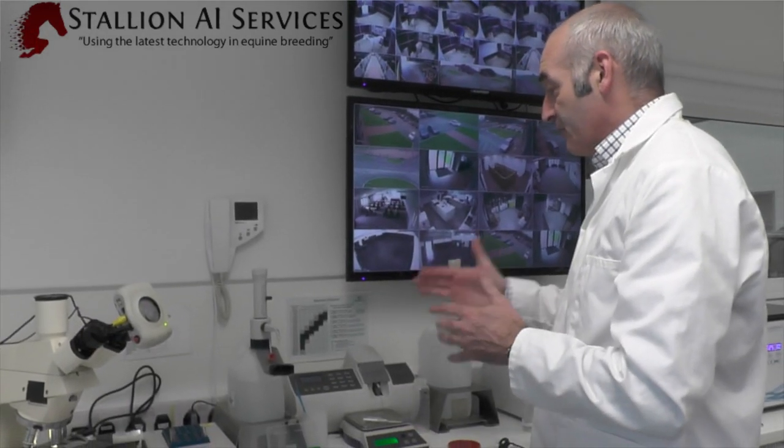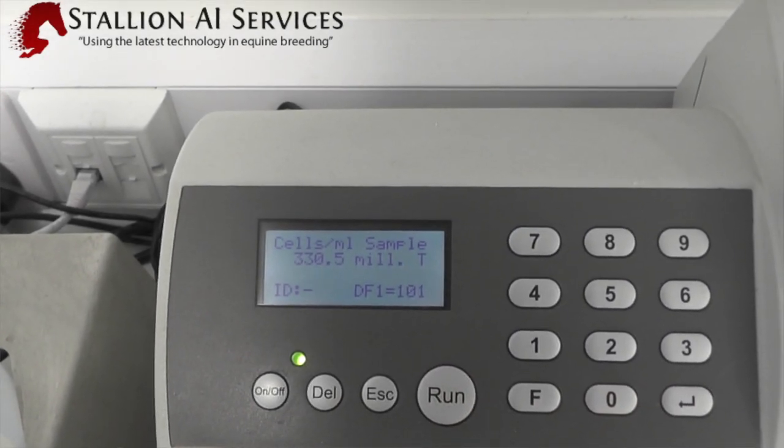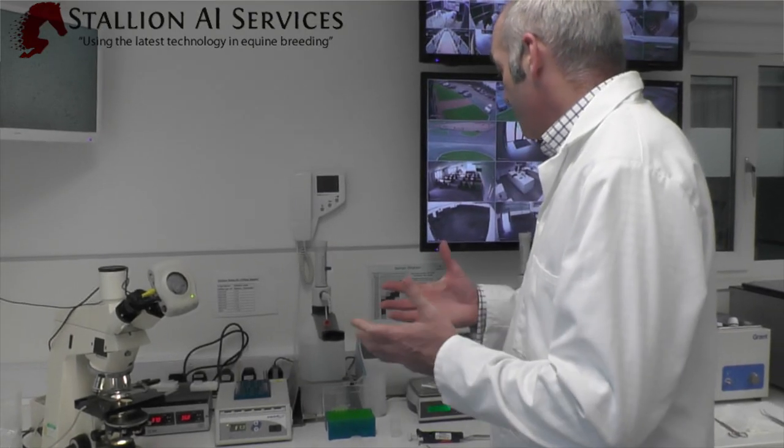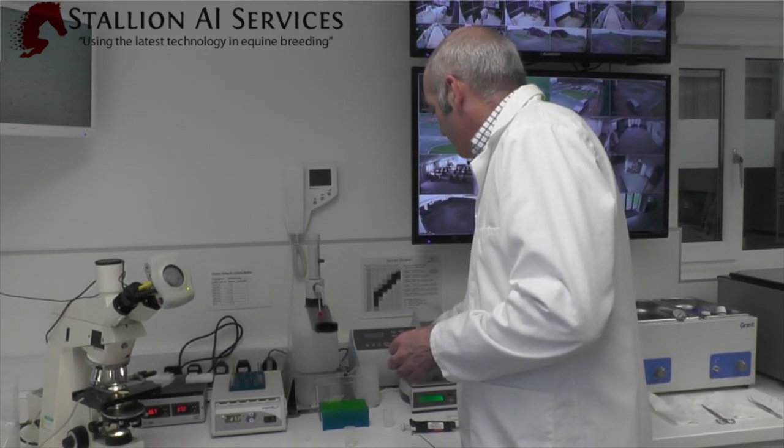We want the concentration to be about 300 million and above — as you can see here, 330 million sperm per mil in those straws. We then replace it with the non-viable stain and press run. This calculates all the ones that are non-viable, and with the total and non-viable figures it can work out what's actually viable. Viability of the semen is really important — I think it's as important as, if not more important than, motility, because if the semen isn't very viable but it's still moving well, the conception rates aren't going to be very good. But if it's still moving well and you've got good viability, you should get really good pregnancy results.